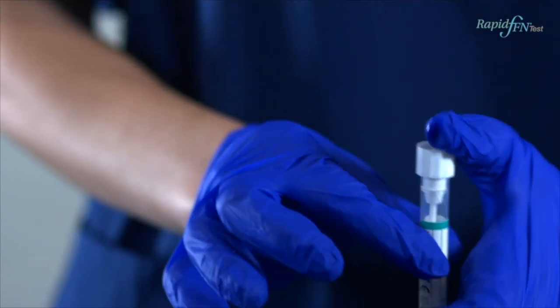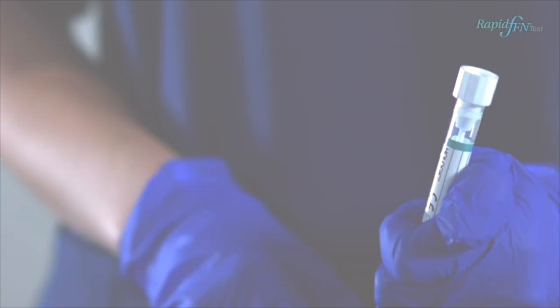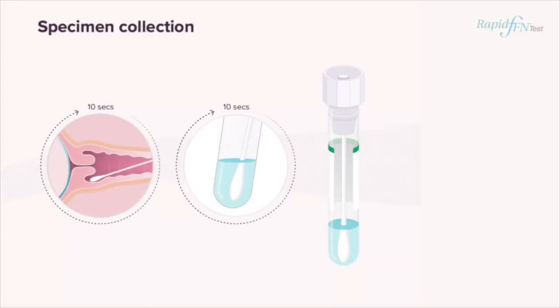To replace the cap of the test tube, align the shaft with the hole inside the tube cap and push down tightly over the shaft, sealing the tube. Ensure the shaft is correctly aligned to avoid leakage. Please note the sample is stable for up to eight hours at room temperature, allowing you a window of time to decide whether to analyse a sample or not.